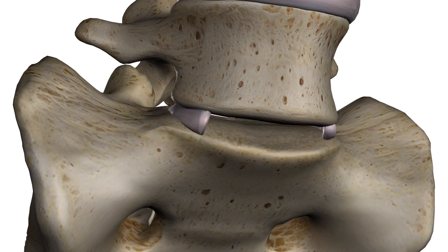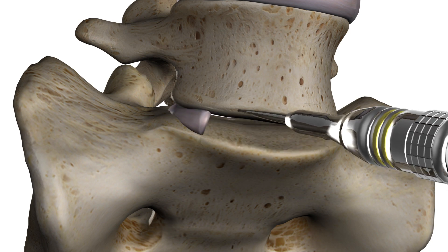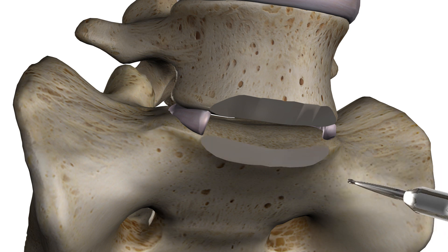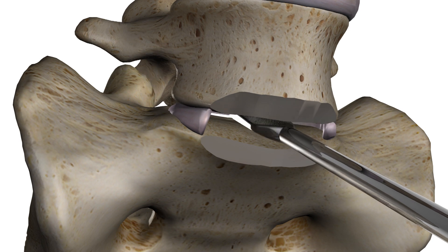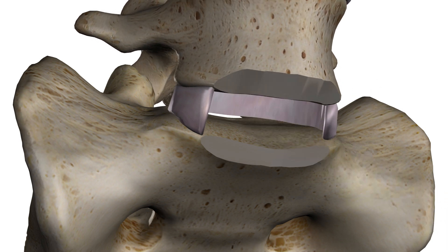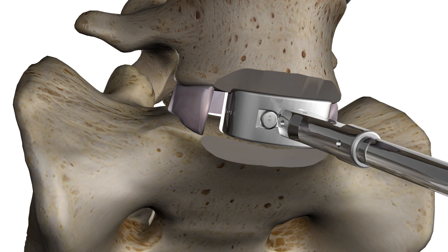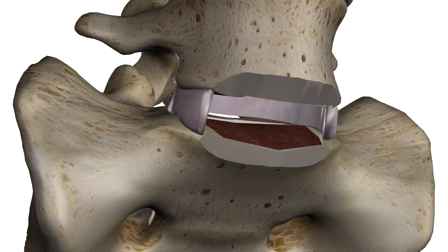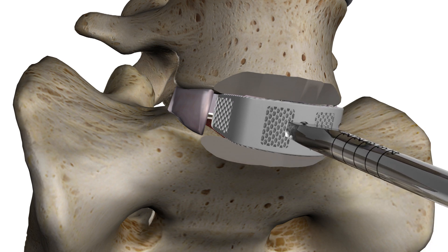First, a discectomy is performed to remove the diseased or damaged intervertebral disc. A trial is inserted to determine the implant size. The interbody device is inserted.